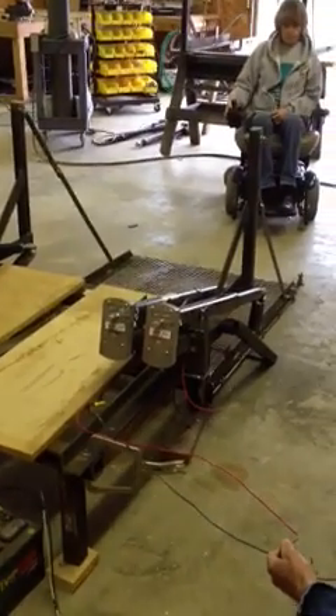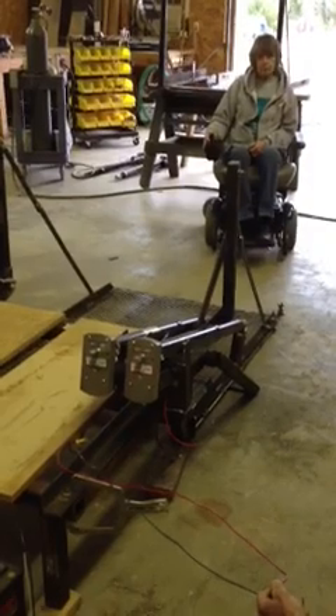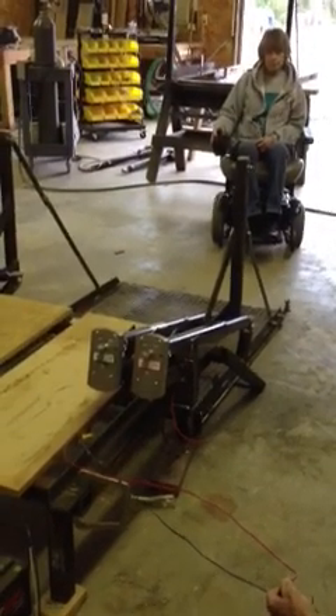This is in the fully deployed position and we're going to put my wife on a wheelchair on this thing and show you how it operates. So come on up.